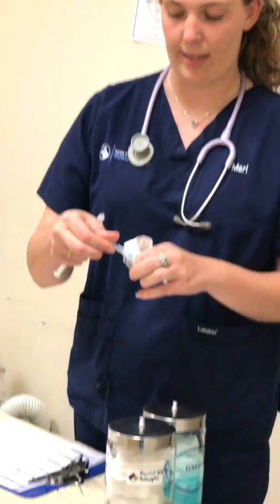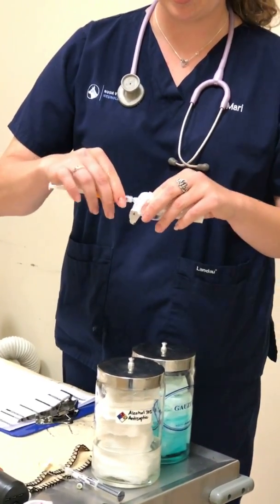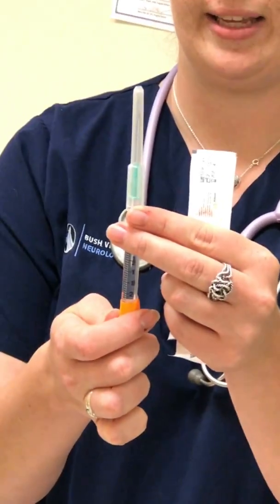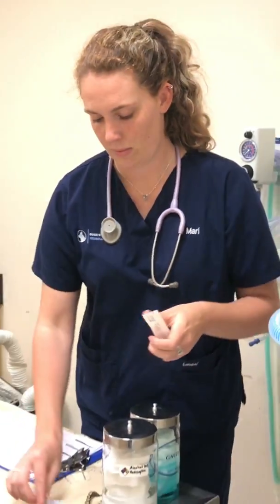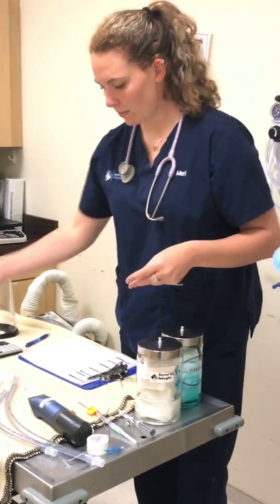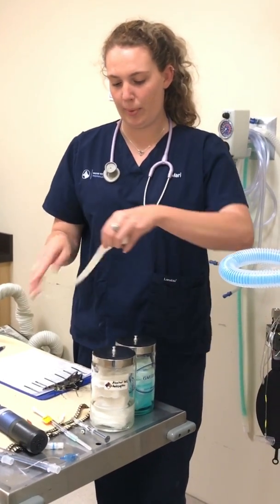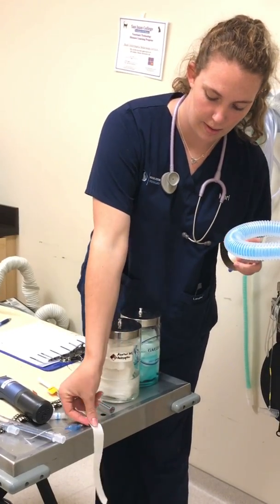I'm just going to go ahead and open that up and flush it appropriately with my heparinized saline. I'm going to take the cap off of the catheter, stick my syringe on the end. I'm just going to flush the saline through until it reaches the other end of the catheter. Set that there. Next, I've got my tape for securing the placement of my catheter. I'm going to go ahead and tear that.